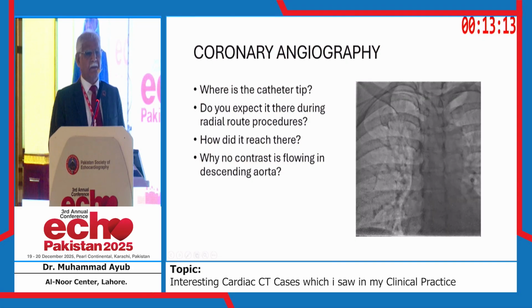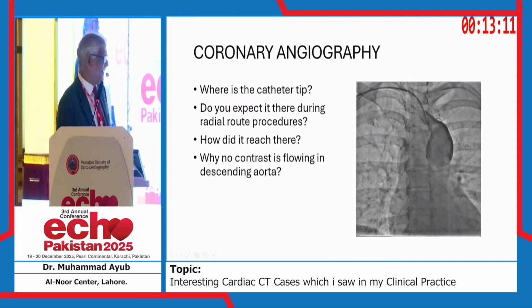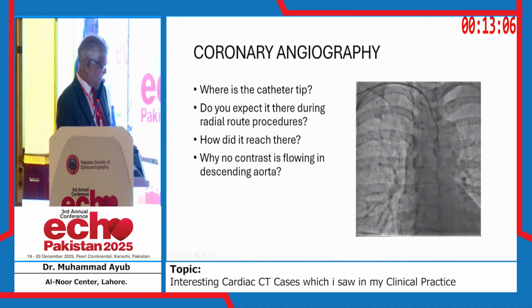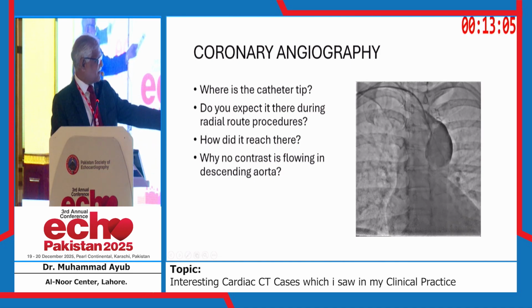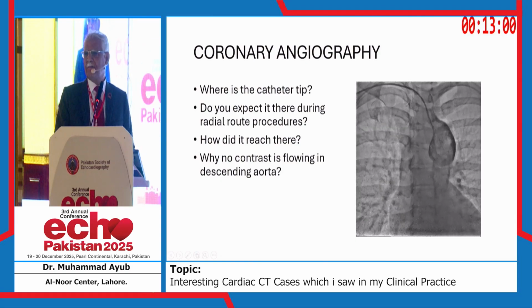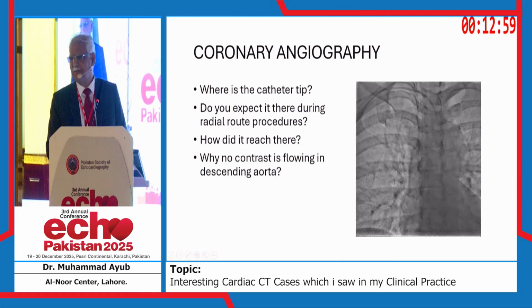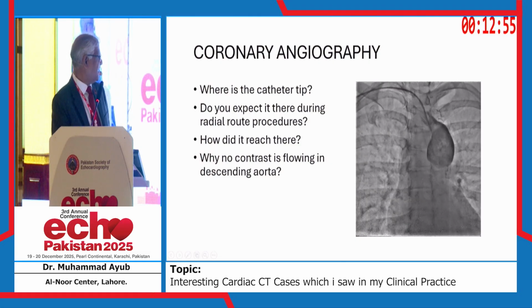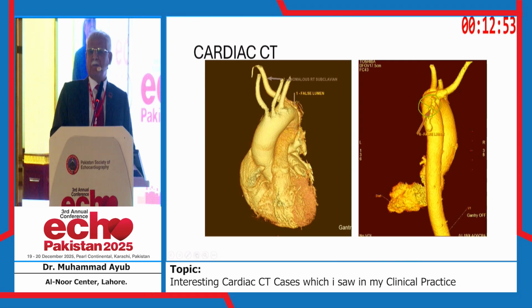Oh, wonderful. But why is the contrast not going down the descending thoracic aorta? Diverticulum. Let's see. Anyway, the procedure was abandoned because the catheter failed to advance, and a cardiac CT was performed.